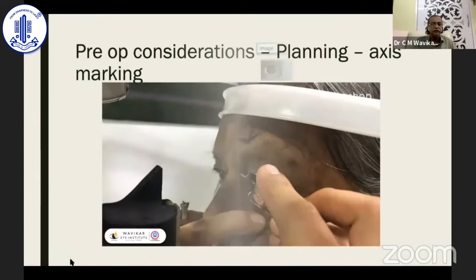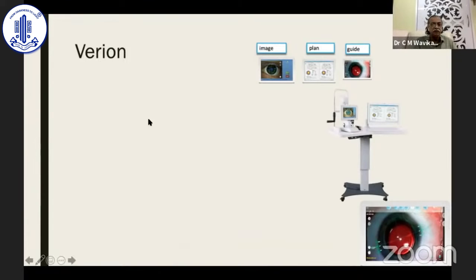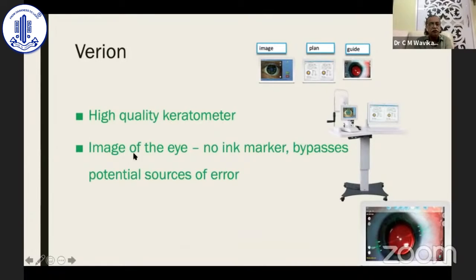What is important here is that previously we were just marking, but now we are marking and measuring it — whether it is exactly at 90 degrees or whatever your chosen axis is. You also have a non-ink digital marker available. It is not necessary to have Verion — if you do marking properly you can still get a good result — but Verion certainly improves the elegance of the surgery. Verion is a very high quality keratometer: it takes images of the eye in the OPD and in the operating theater and matches them in a process called image registration.